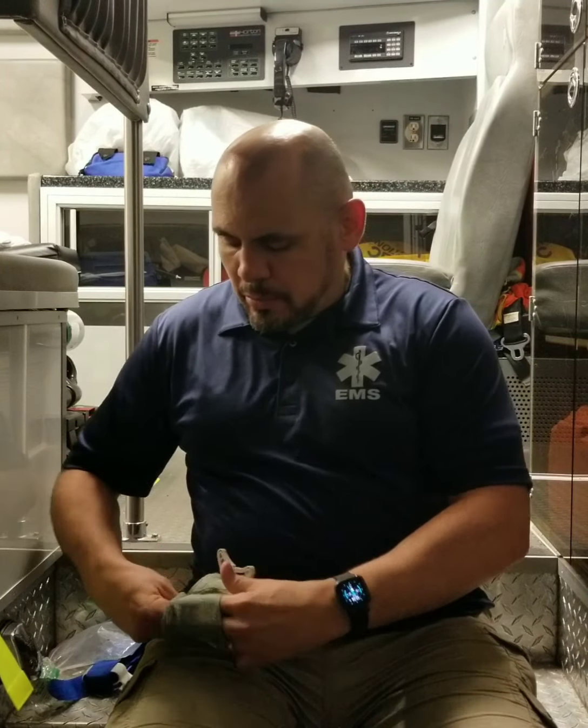Obviously, if the wound is on your leg, this is a lot easier to do. You wouldn't feed it through a loop. You would just, again, put it there, feed it through. Take the bandage. You're trying to put this particular loop. I don't know if you can see it from the camera angle. Feed it through, turn around. Again, this is what's going to create the pressure. Pull through it, wrap it around, get to the hospital.